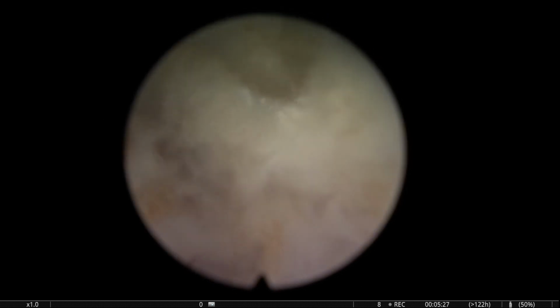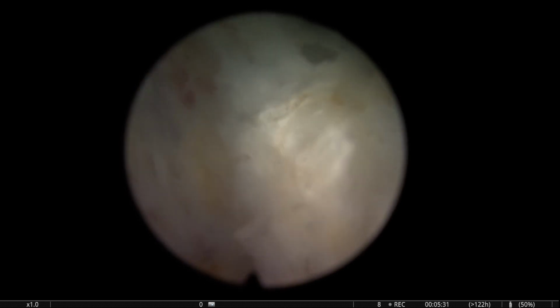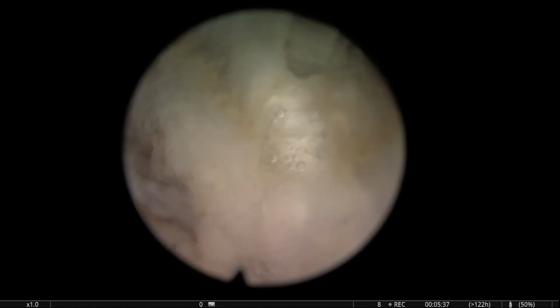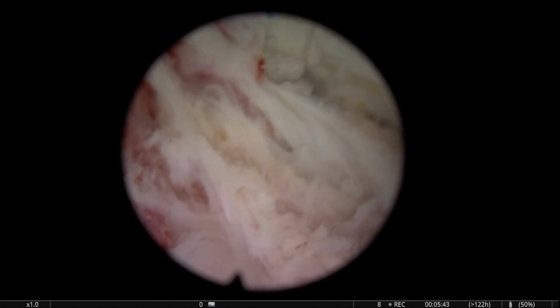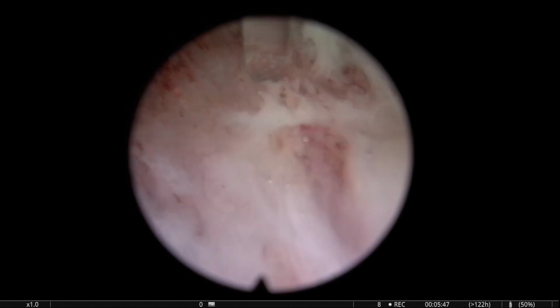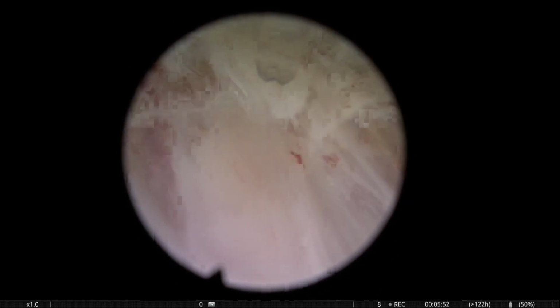That's why I'm pointing the fiber outwards to see if I can find the capsule external to these nodules, which is not easy. You notice that in order to keep oriented, instead of digging deep in one small line in the adenoma, I always try to do broad lines.